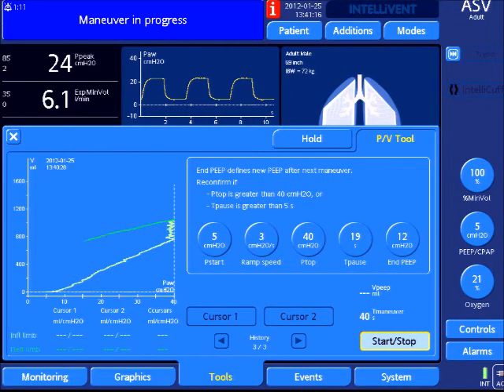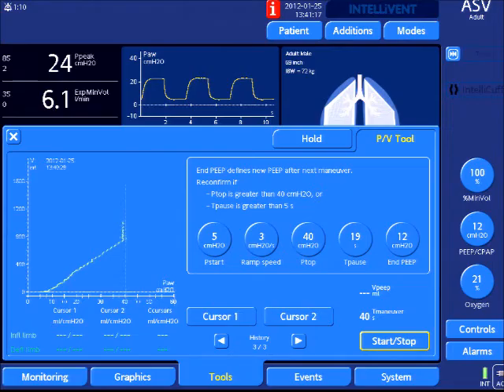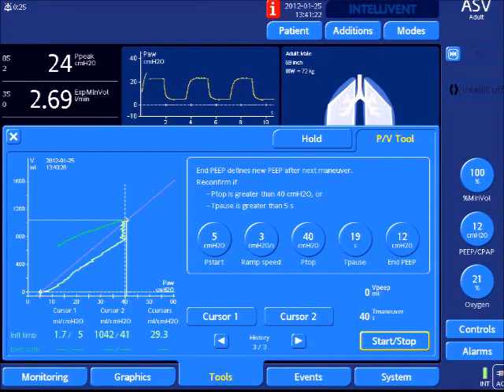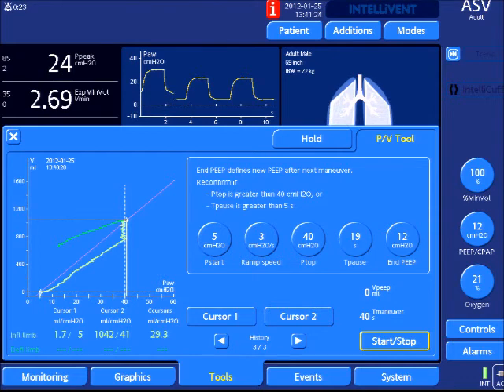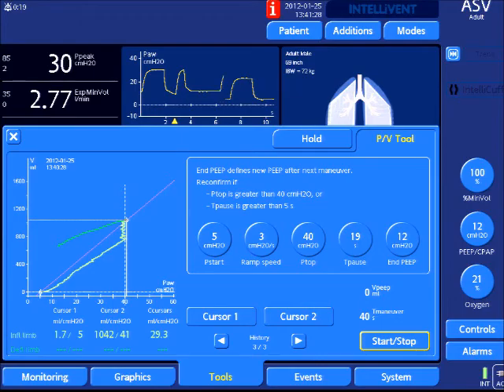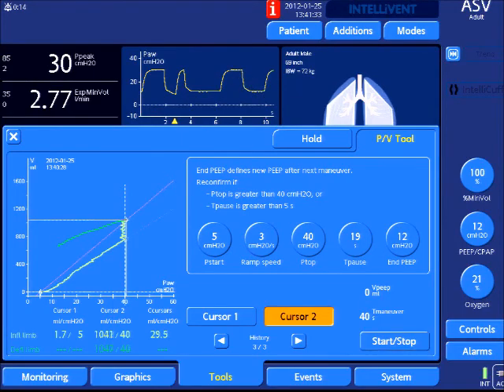Now is the deflation limb, and as you can see, it's a very wide hysteresis. This lung is recruitable, and by adding extra PEEP or placing the patient on airway pressure release ventilation may be beneficial for this patient.